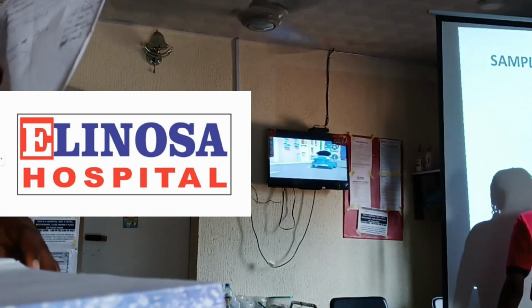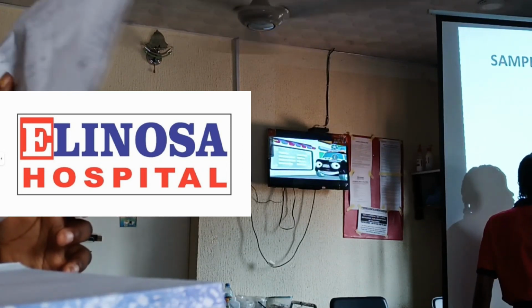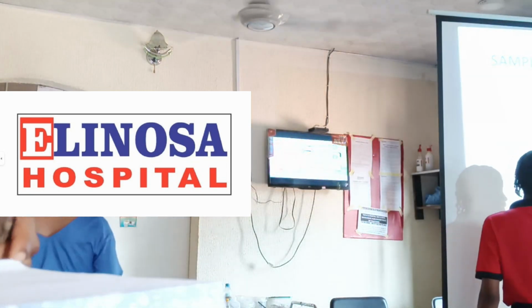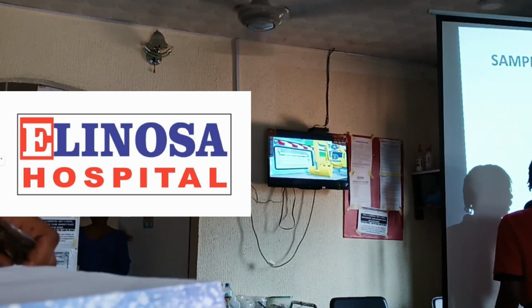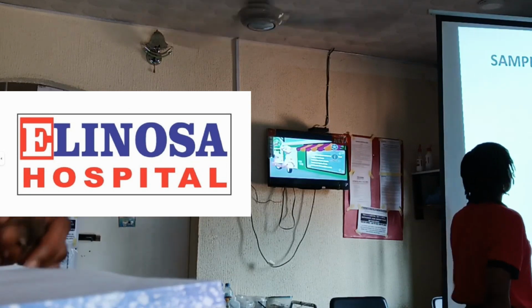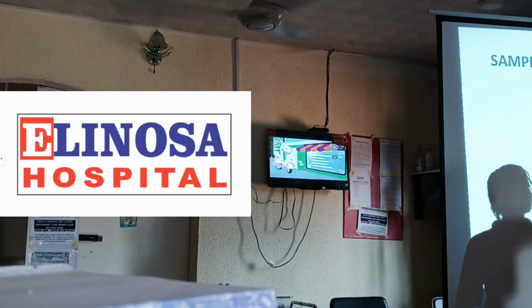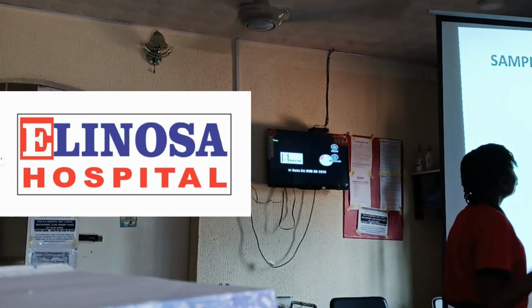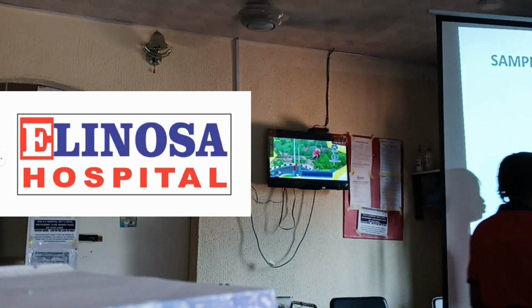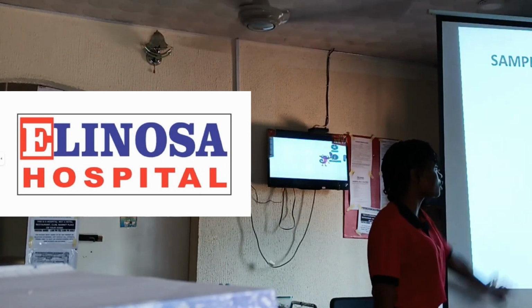Now this is another form of sample preservation. This one, you just make a smear, then you air dry. After you air dry, you stain with any stain that is made available. You air dry again, and you store it in your slide container. It can be there for 2 years, 3 years, nothing will happen to it. So that's another way of storing your sample. Now this is a swab sample. Please and please, like I said just now, do not store your swab samples in the refrigerator. Just inform the laboratory to run the test immediately, as soon as possible.